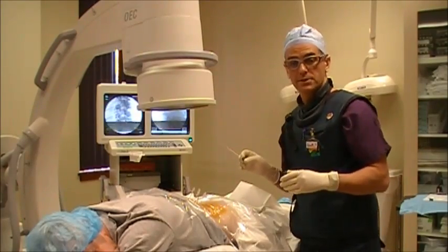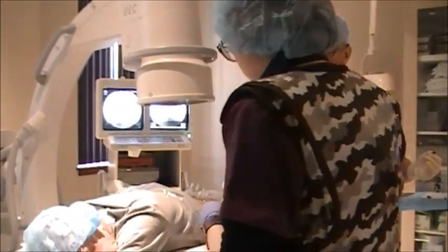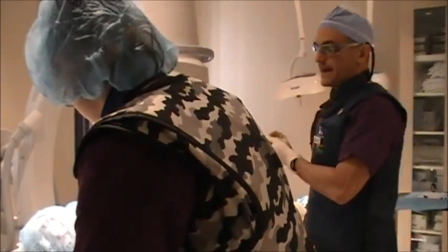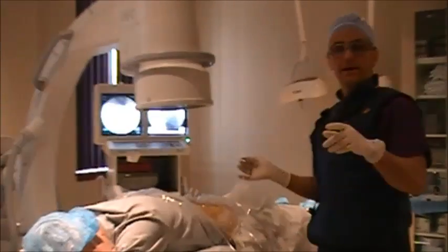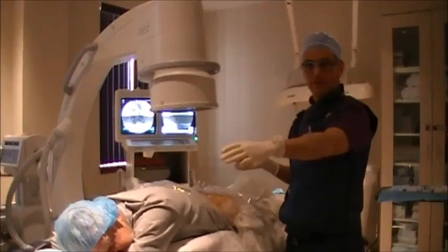and we would have to readjust. Went ahead and hooked up the probe to the extension cable, which is hooked up to the machine. I'm not sure if you can see, Ashley, but I'd like you to show the radiofrequency generator.